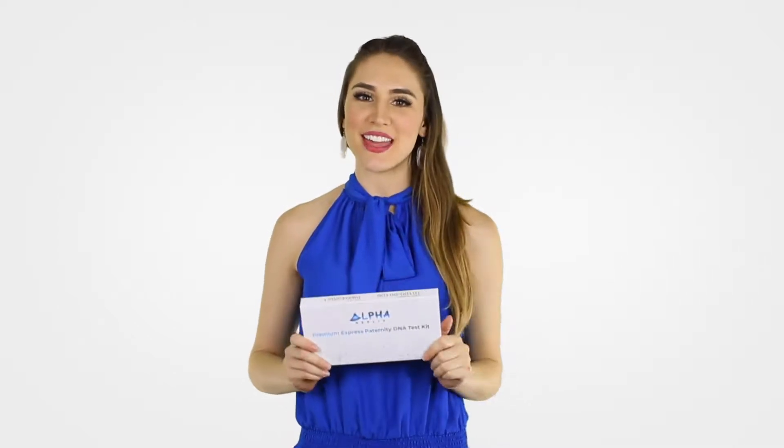Hi, I'm Allie with Alpha Helix. If you need an accurate, reliable, and confidential paternity DNA test, this is exactly what you need.